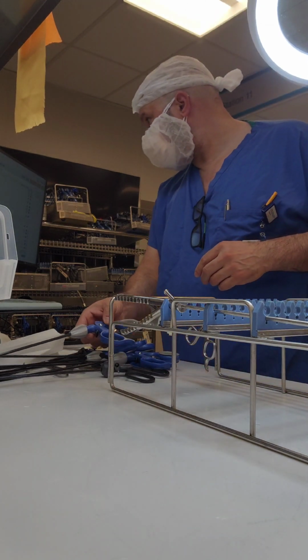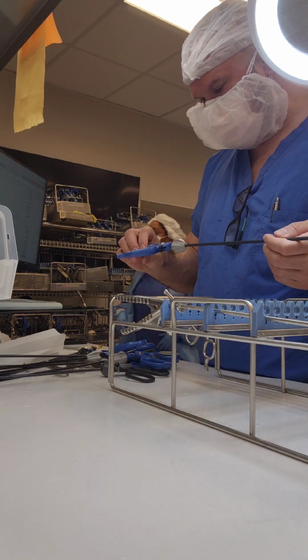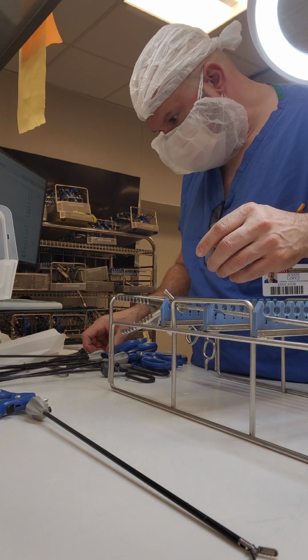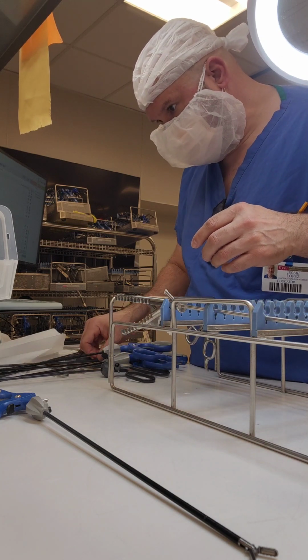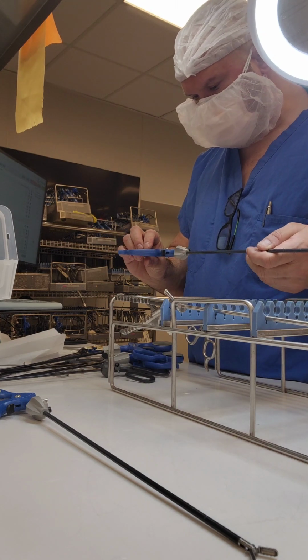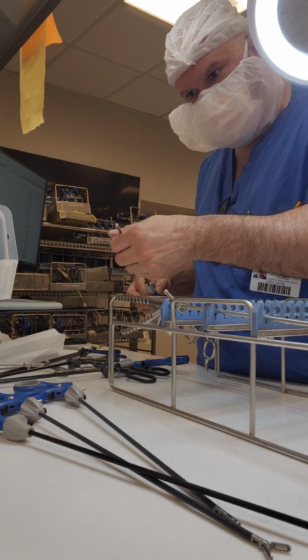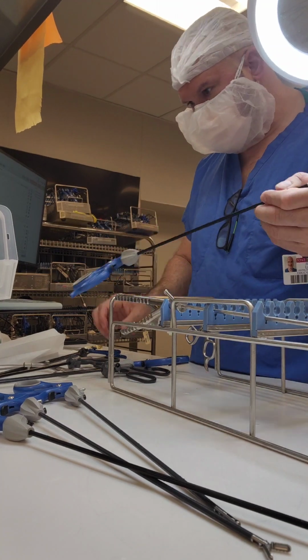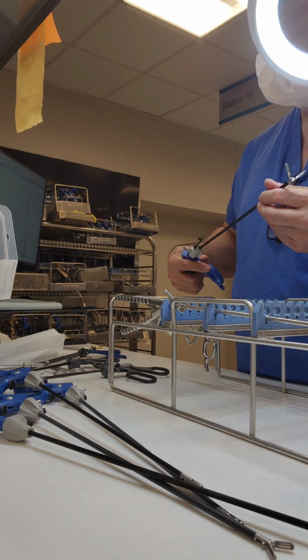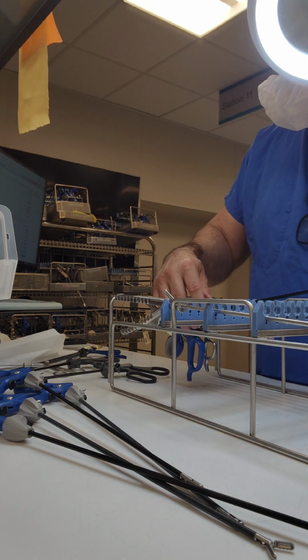Again, you see I just paused the video and unpaused it because I had to take care of something else. Again, this usually throws me off my groove, so I forget where I'm at on my count sheet. And this is where I have to look for numbers on the sheet. I'm not completely familiar with these instruments. I can probably look at the tip and know, but for some reason I had to look at that part number to ensure that I had what I was looking for.